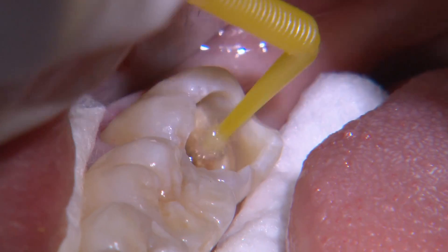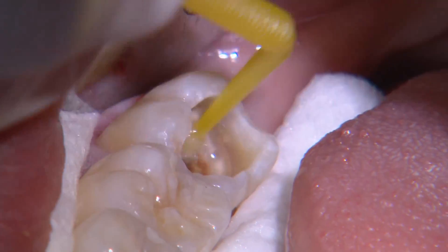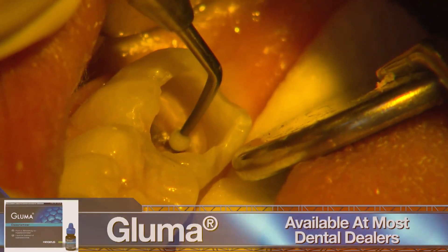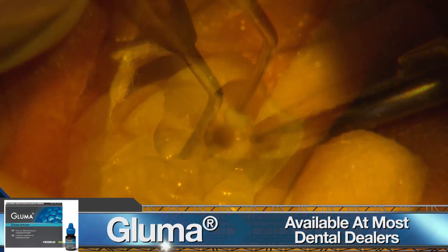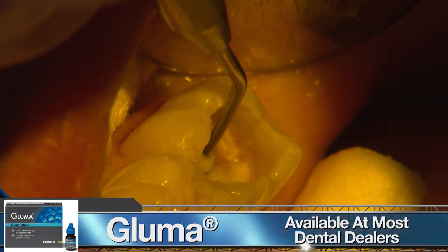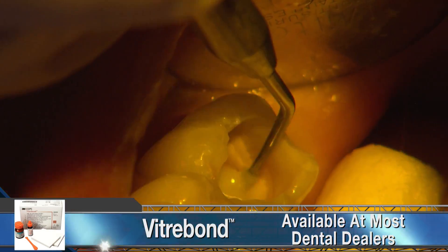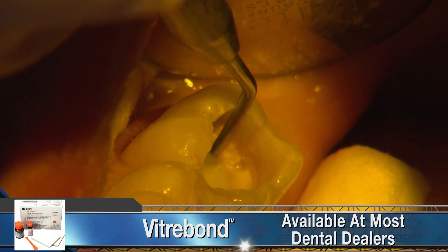At this depth, I condition the cavity with polyacrylic acid for 20 seconds and then apply gluma for a minute. We then complete the indirect pulp cap with a thin layer of Vitro Bond along the pulpal floor. Now the cavity is ready for bonding.